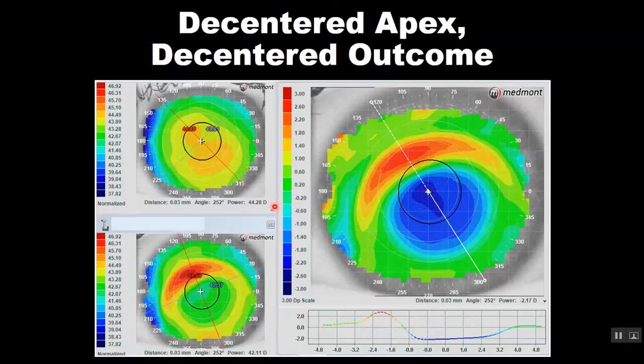And sure enough, if we look at how the contours seem to be pulled down and out on this left eye, that's where the treatment zone follows. The lens follows the natural displacement of eye shape. Baseline cornea down and out, treatment down and out.